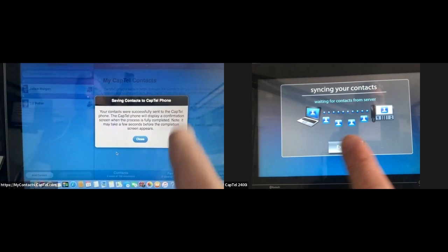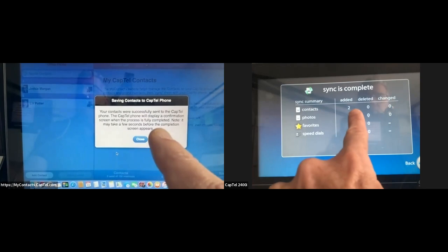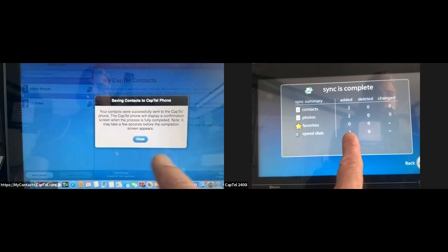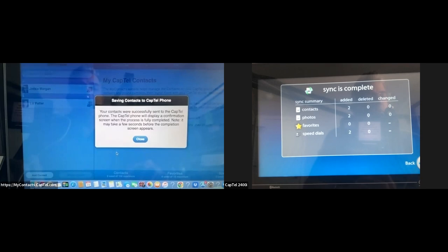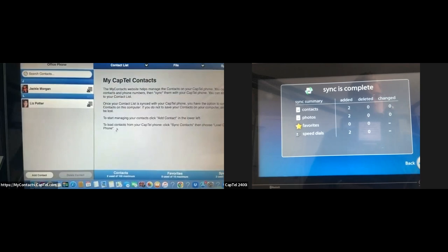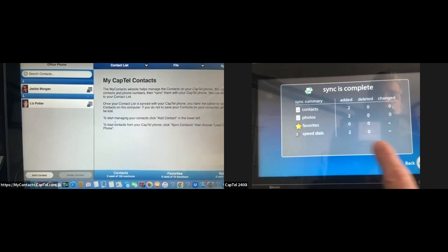Looking at the CapTel display, it shows the process. It says sync is complete — I've added two contacts, two photos, no favorites, and two speed dials. And on the laptop, it says your contacts were successfully sent to the CapTel phone. The CapTel phone will display a confirmation screen when the process is fully completed. It's really self-explanatory. This will be your website whenever you want to add contacts to your CapTel phone.